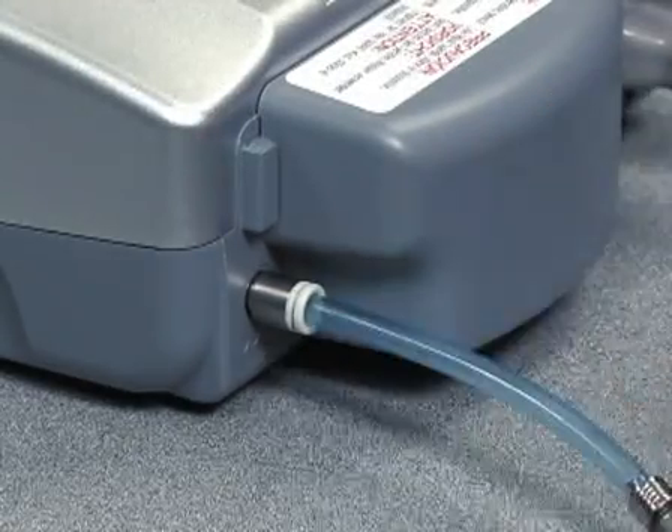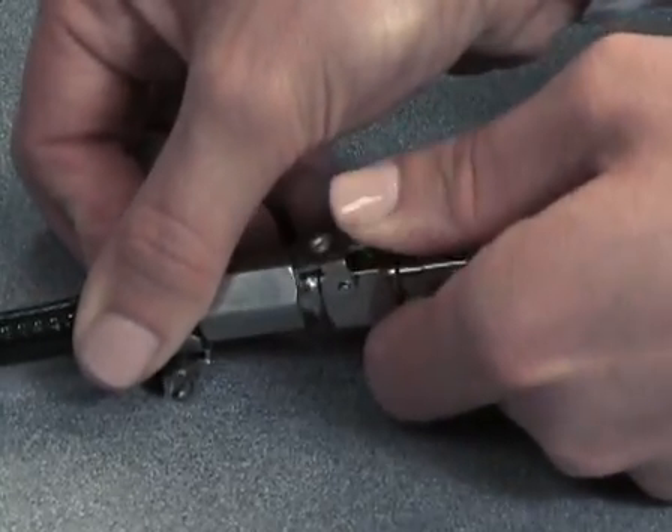Carefully check all water supply connections prior to startup to ensure that they are securely attached.